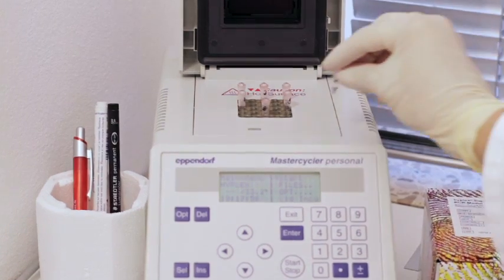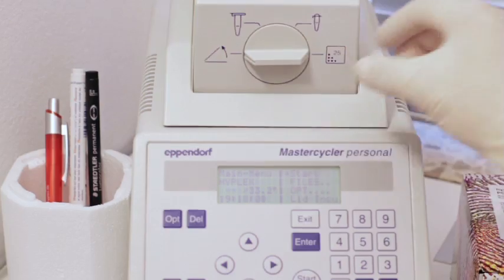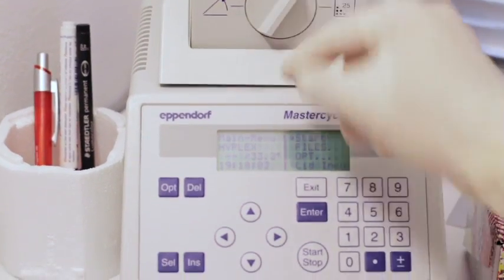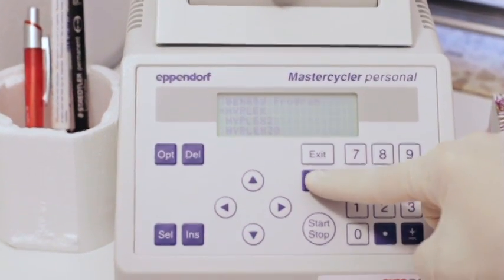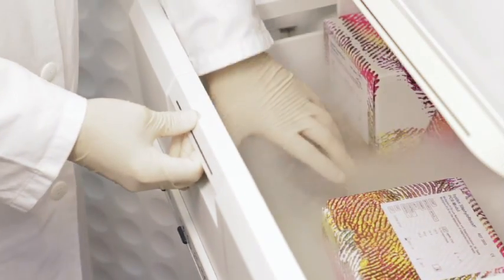Put the tubes into your PCR device with lid heating and perform the HyPlex PCR program, which you can find in your instruction for use. After running the PCR, the workflow of the test can be interrupted overnight or longer.